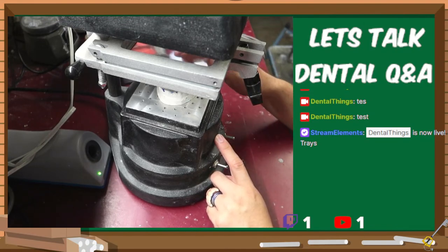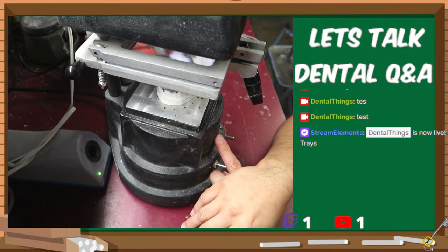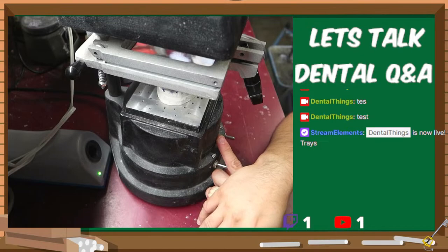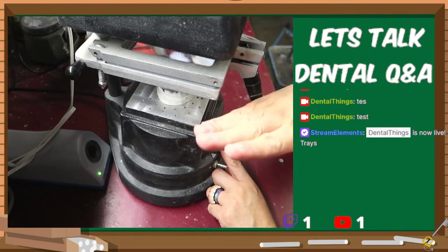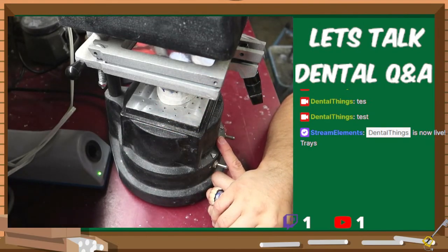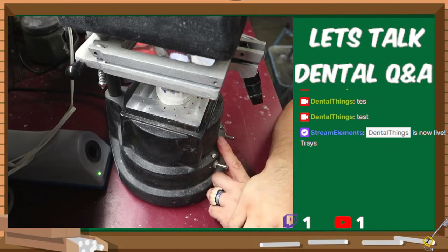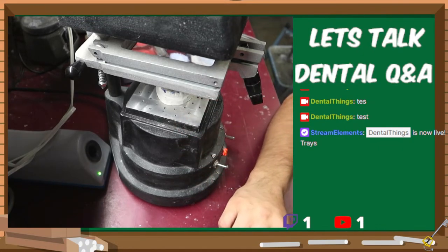All right, now I'm starting to get a little bit of sagging, a little bit of melting of my material, which is good. Right now it's kind of just waving. And from here, I'm going to be dropping this pretty soon. And then it's gonna get loud, which I will go and hit this part when that does happen.